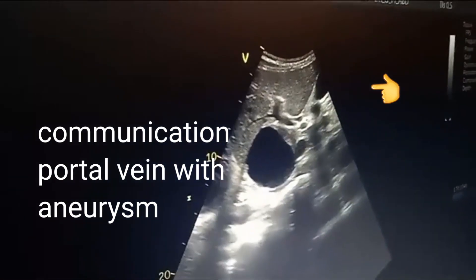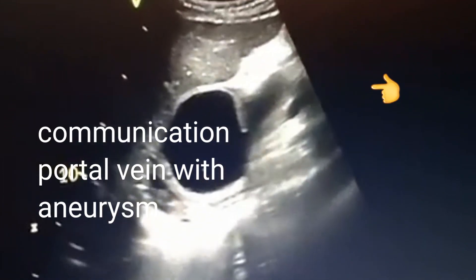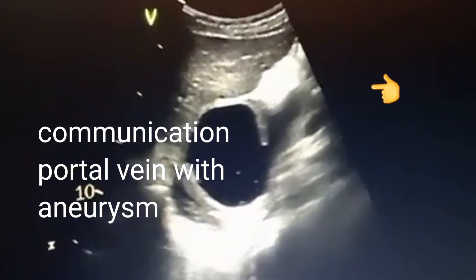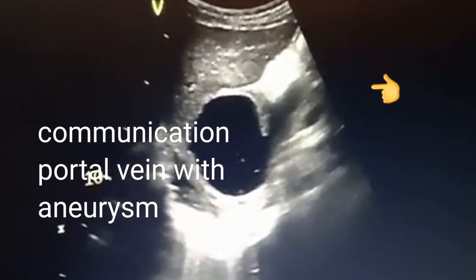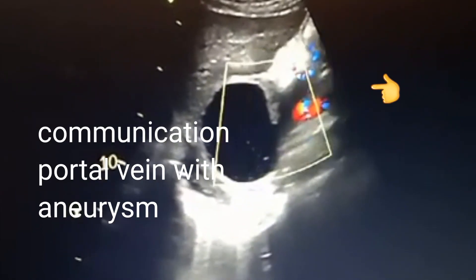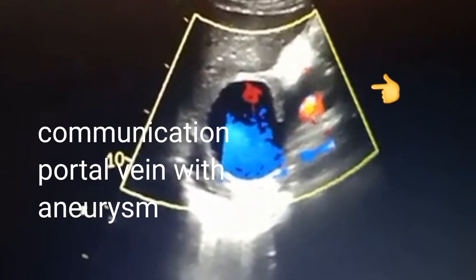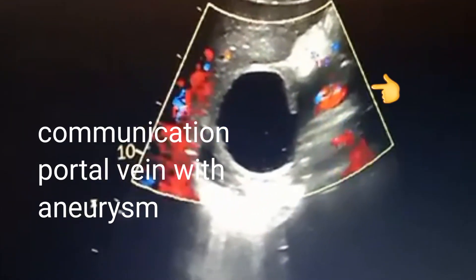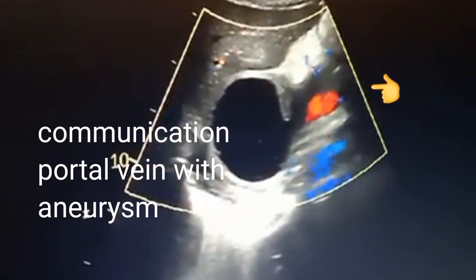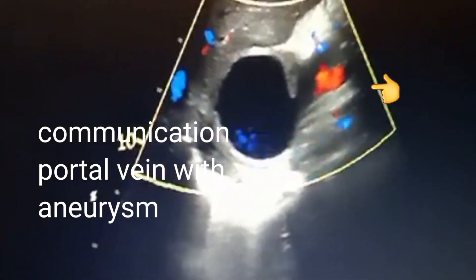The above sections of the portal vein show direct communication between the portal vein and the aneurysmal sac arising from the portal vein. Color Doppler shows communication between the portal vein and the aneurysmal sac.